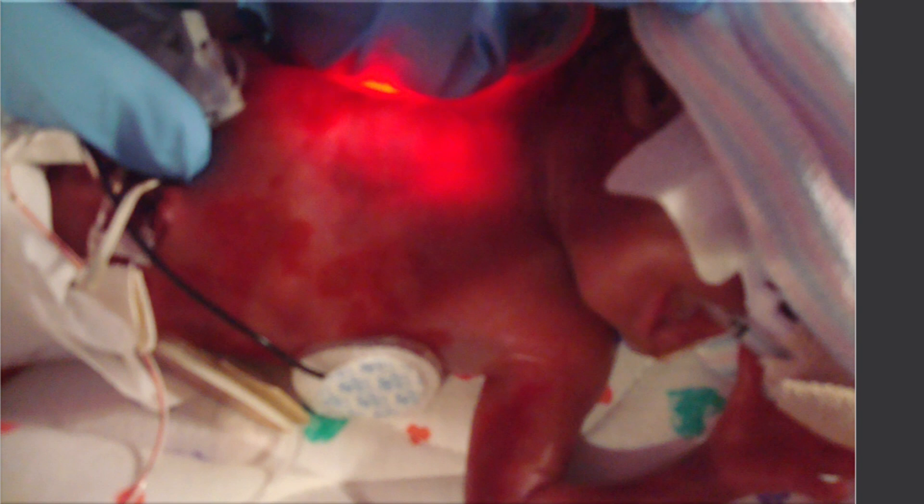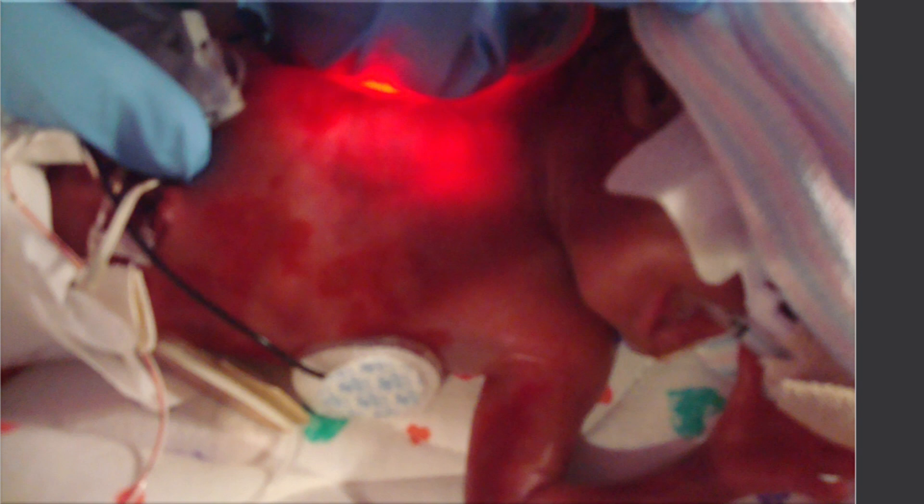A quick, non-invasive technique to assess for pneumothoraces is transillumination of the chest wall. In this instance, a cool light source is placed against the side of the chest wall with the pneumothorax. The light illuminates or radiates across the chest, as seen here, rather than simply forming a halo around the light source.